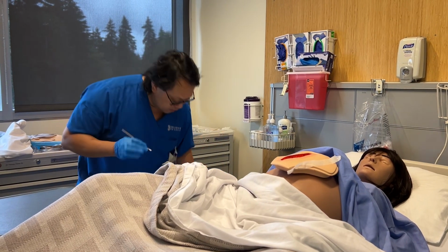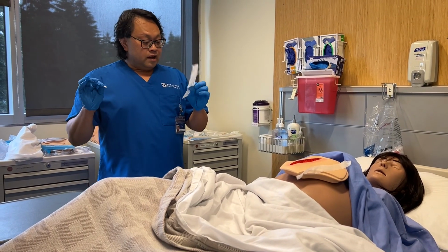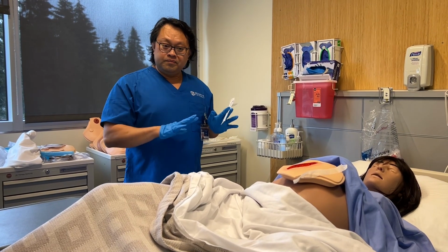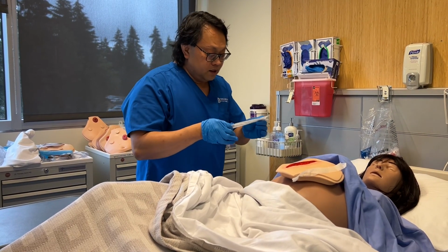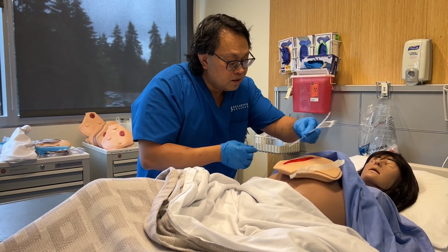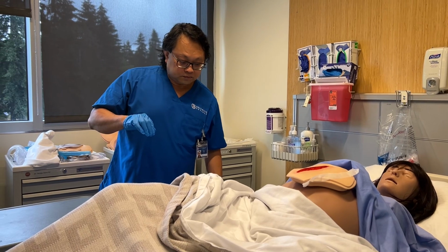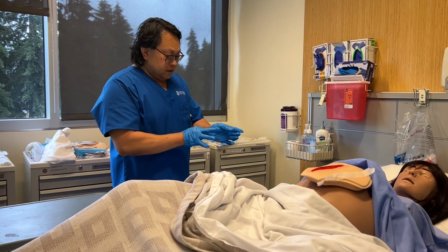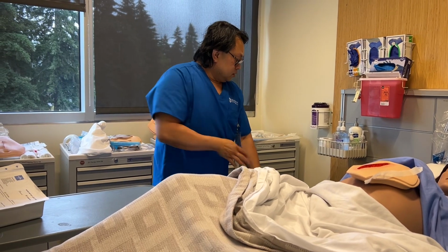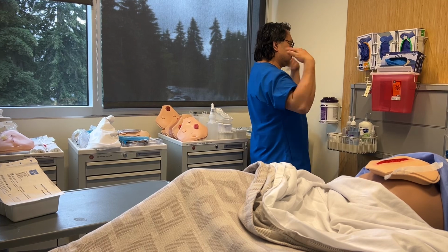So, oops, I didn't mean to throw away my ruler there. And it is 3 centimeters, okay? Again, and then by 11 centimeters by 2.5 centimeters. And we're going to throw that away and document that. Now I'm going to set my sterile field. I'm going to change gloves, sanitize.